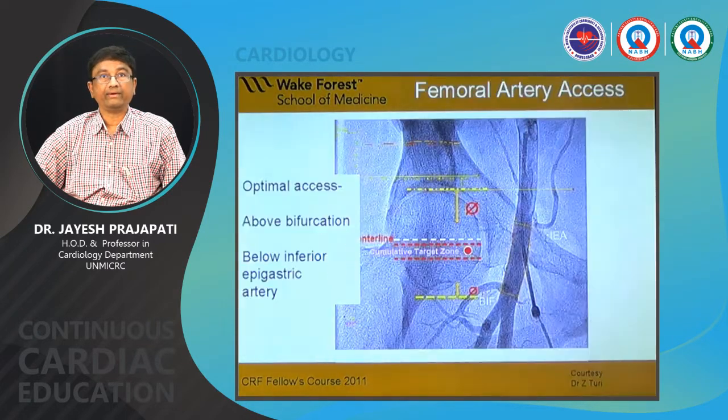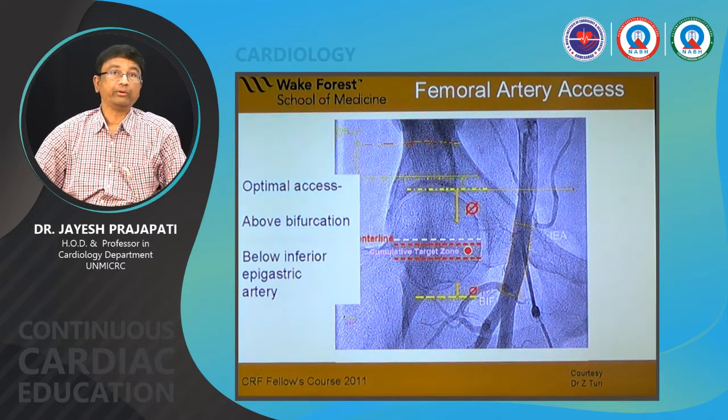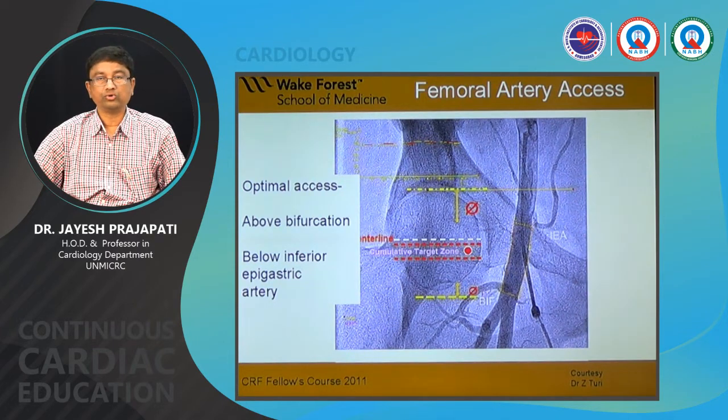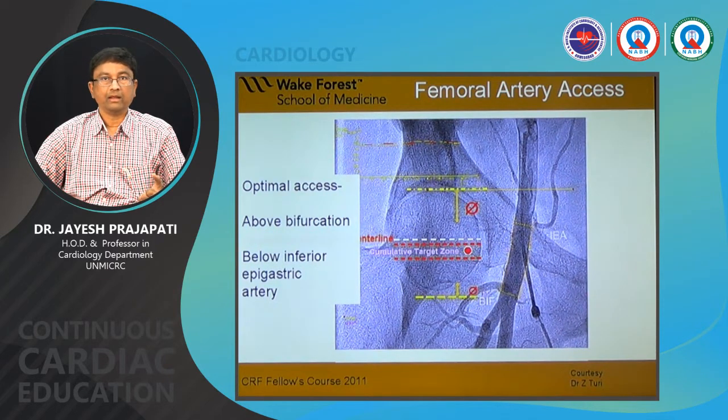So this I have already discussed, and now I am going to move towards femoral access. In femoral access, you have to be very punctual. Your site should be perfect. It should not be too high, it should not be too low. Some people, to avoid the retroperitoneal hematoma, take a low puncture. But with a low puncture, they carry a high chance of AV fistula and high chance of pseudoaneurysm, because of the hematoma. Once it gets organized, sometimes it develops a pseudoaneurysm from the back side.